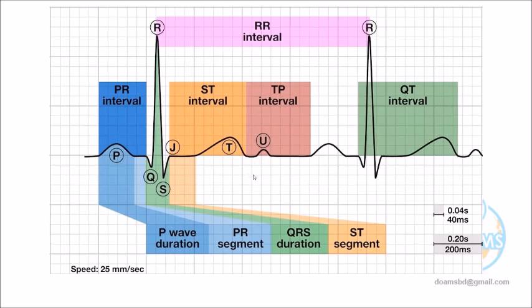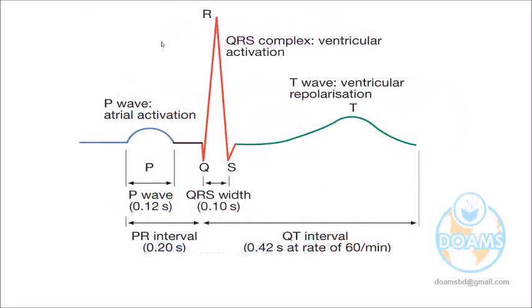Another word is the PR segment. Doctor, look at the PR segment. Ending of the P and beginning of the QRS. So this is the PR interval. These are the segments. There is a difference. If anybody doesn't know, please quickly raise the hand. Otherwise, we're switching. I hope all of you know; we are just refreshing your memory.